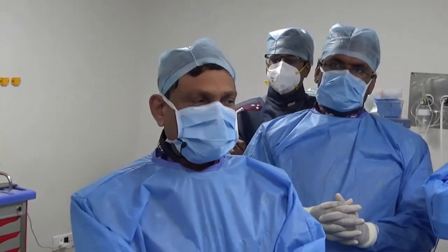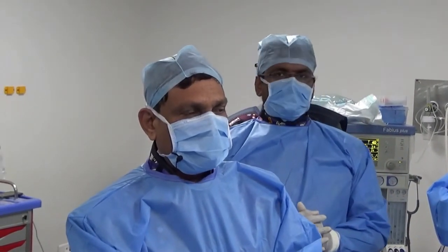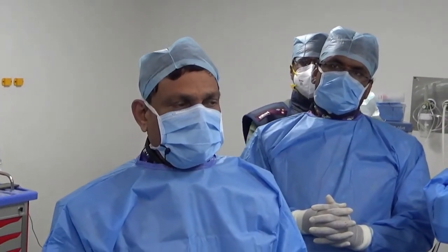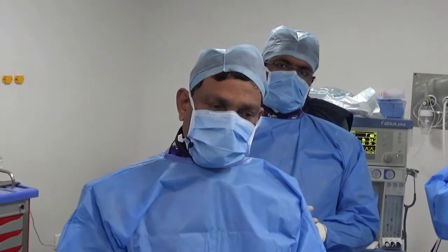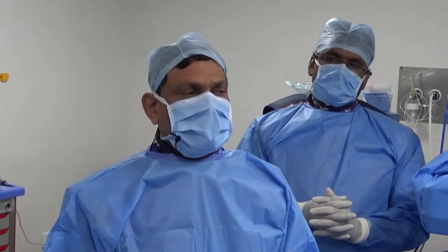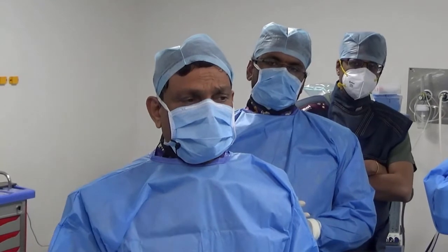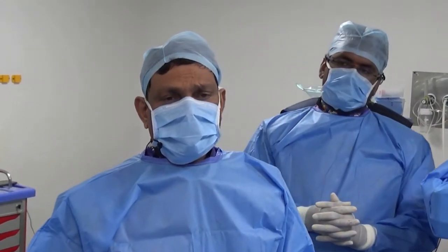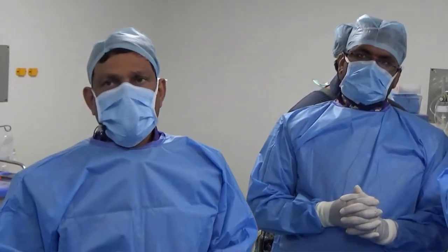That's the reason I thought I'll pull the device as much as possible close to the arterial side, and then once we pull this, we can push the arterial disc away from the OM. If you are doing it from the venous side, I will not have much option of pushing the low pressure disc close to that, because it is a non-centered disc. So that is my thinking.